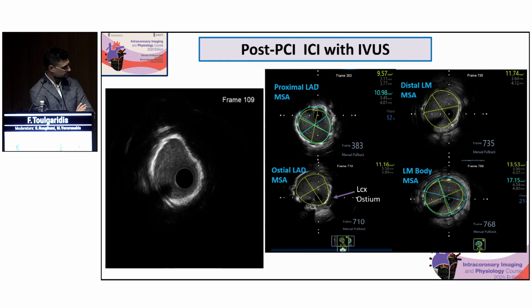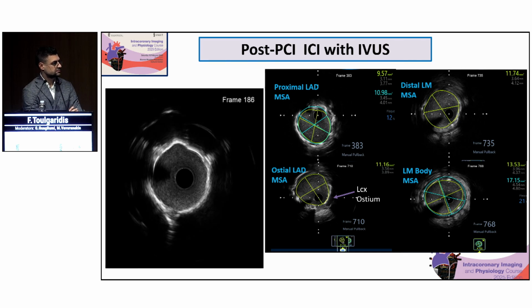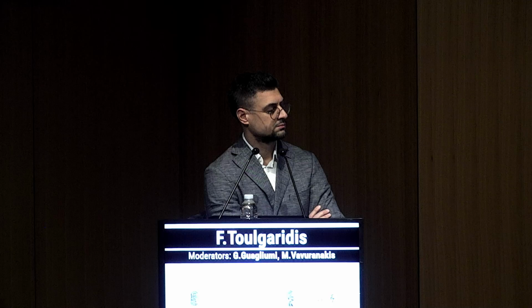It's a very good, excellent result. Any comments? I think that very nice job and excellent result also. I think that it is needed to do some IVUS after the modification technique. Not only to confirm that there are the cracks and all the modification that is done had the result, but also for better sizing after the expansion of the vessel and after the calcium modification.